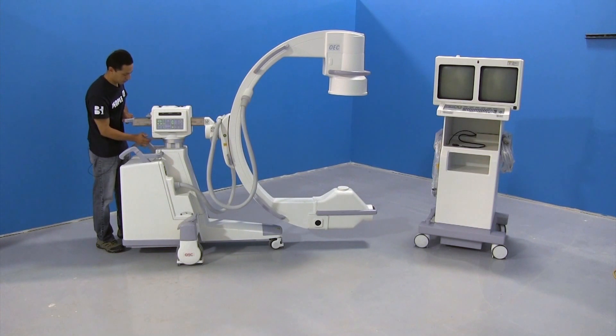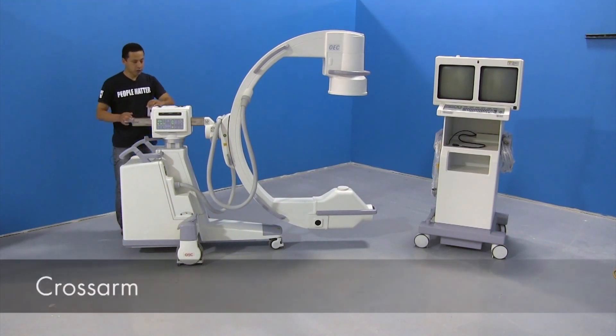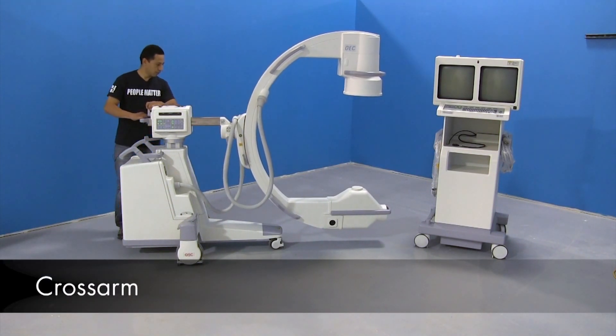Put it back in the center and lock it down. You have the cross arm, which you go forward and back.